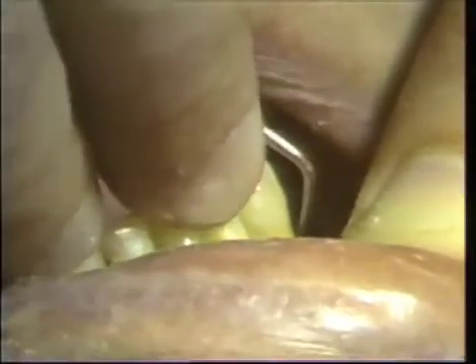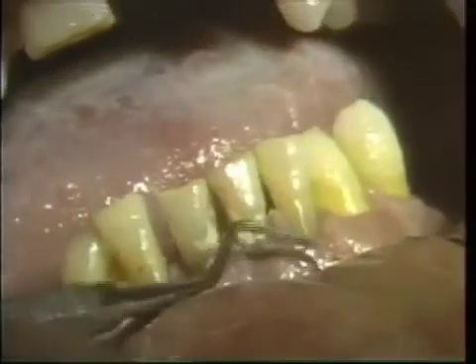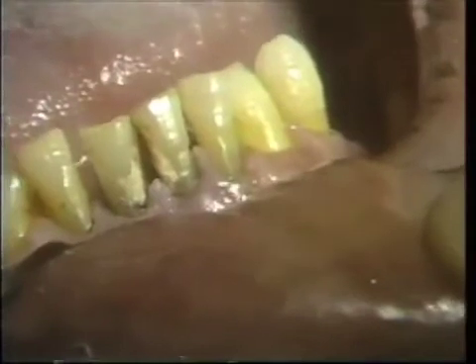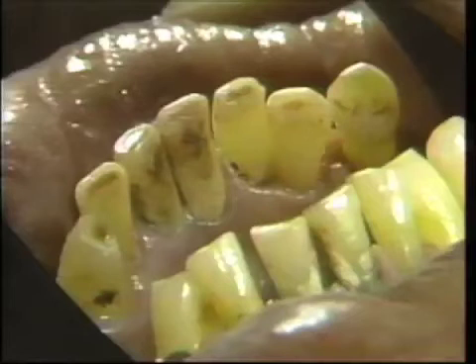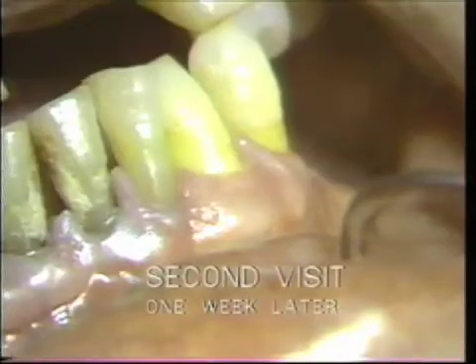The scaling is being performed without anesthesia. After the regular rubber cup, we also used paper strips for polishing. Note the tissue reaction immediately after the scaling on the left side. On the lingual aspect, there is some calculus left, which will be checked on the second visit.